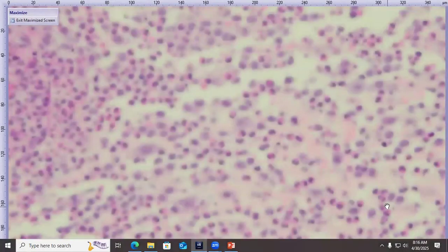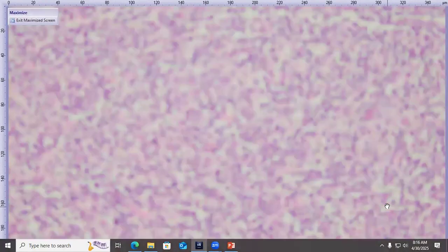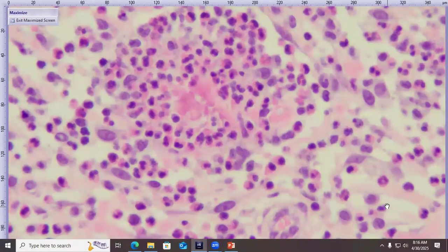We had a spell not too long ago where H&E was almost as good as toluidine blue for some mast cells. But yeah, you're right, not lately, I don't know. Yeah, they almost look like cat mast cells. I asked Cody about it. He said if we change a little bit the pH of some of the reagents, that might cause some minor changes. Interesting. Okay.